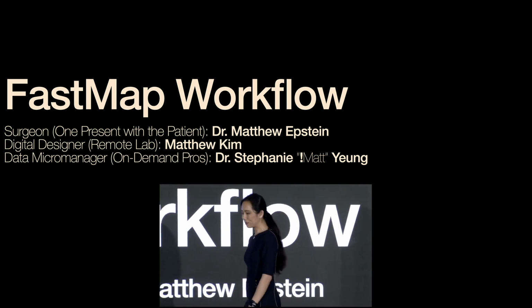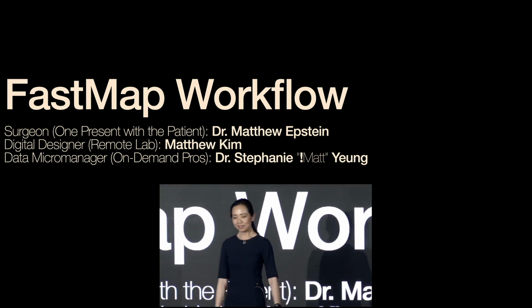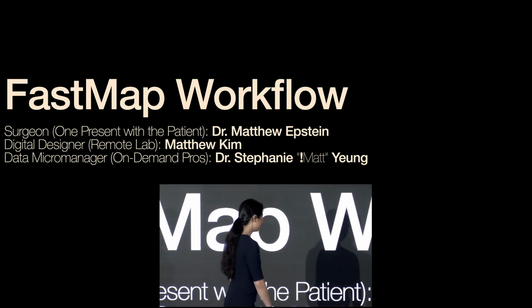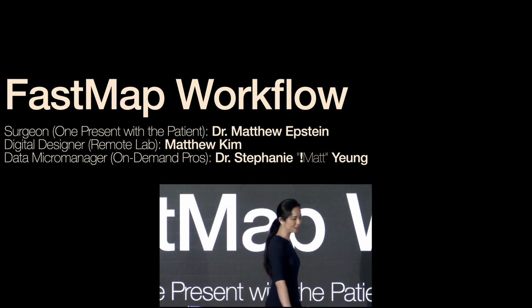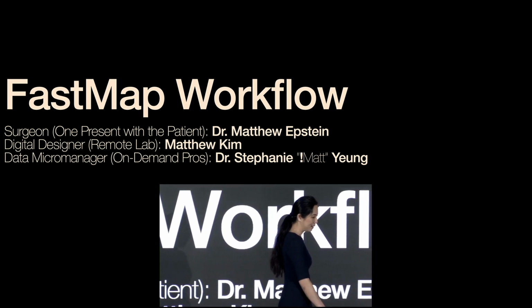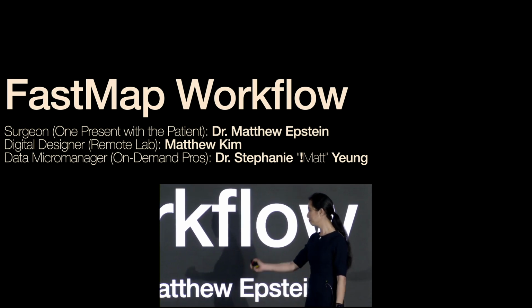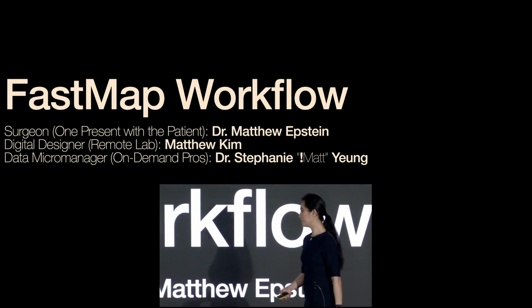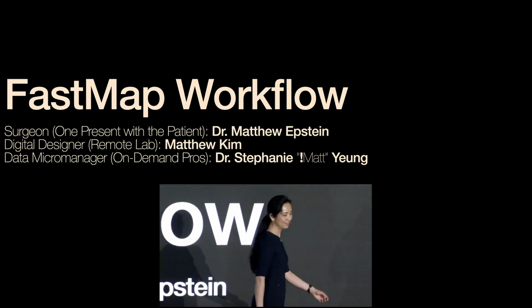In terms of the FastMap workflow, I'm going to walk you through how everything can go from start to finish. We're going to work through one patient together. This is with a local surgeon who is the only one who ever met the patient before, Dr. Matt Epstein. And the digital designer I worked with on this case is a remote lab technician who works from home, Matt Kim. And the data micromanager, or me, the on-demand pros, is me, not Matt Yeung.